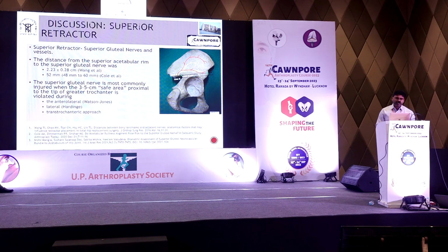Now coming to the discussion part. What are the structures which are at risk, which we should be aware of, and is there anything to be scared about? The placement of the superior retractor is important from the perspective of the superior gluteal nerves and vessels. The safe distance is 1 inch from the edge of the acetabulum. So if you put your pin within an inch of the superior edge of the acetabulum, you are pretty safe. Various cadaveric studies have shown that the superior gluteal nerves and vessels run around 1 inch to 2 inches away from the edge of the acetabulum.